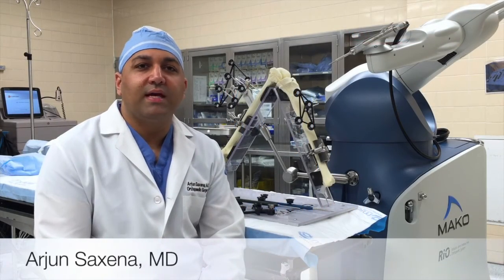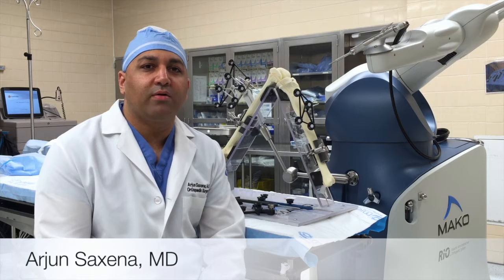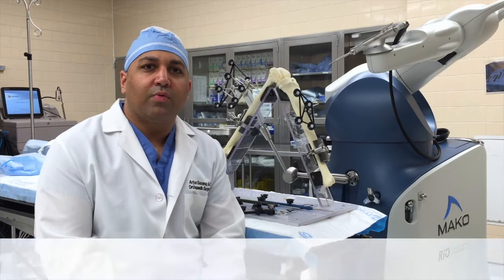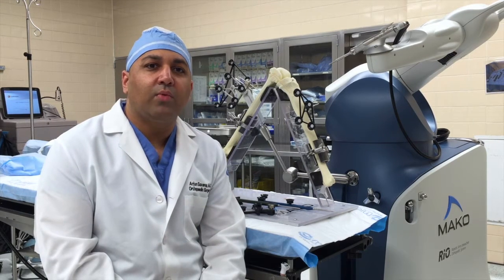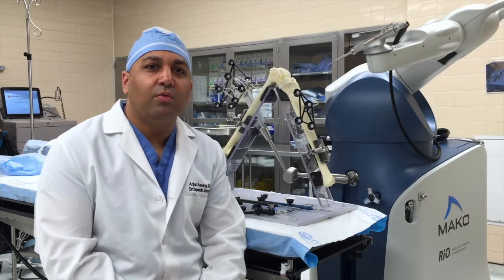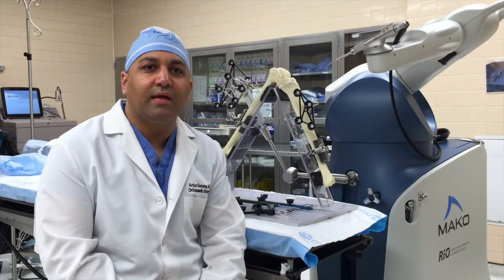Robotic surgery is a great way to use technology to provide our patients with better results. With robotics, we can have more accurate results and take away less bone, preserving more of their natural bone, ligaments, and tissue.